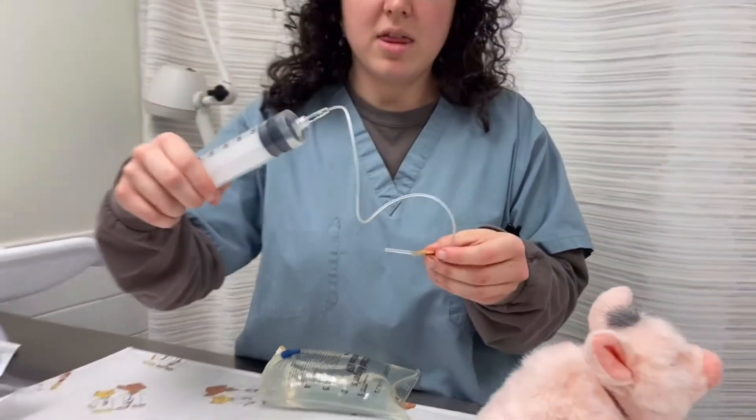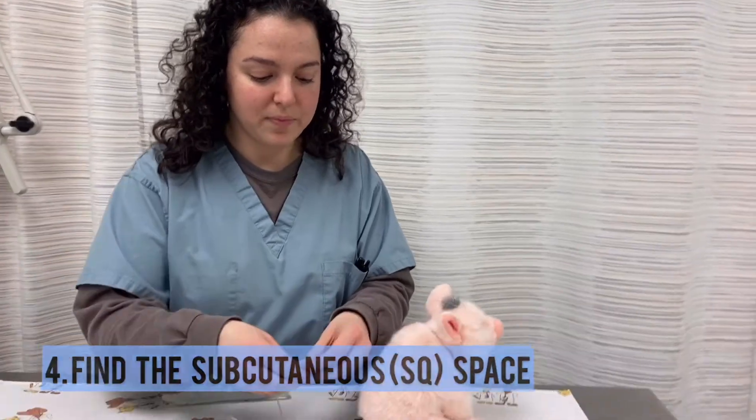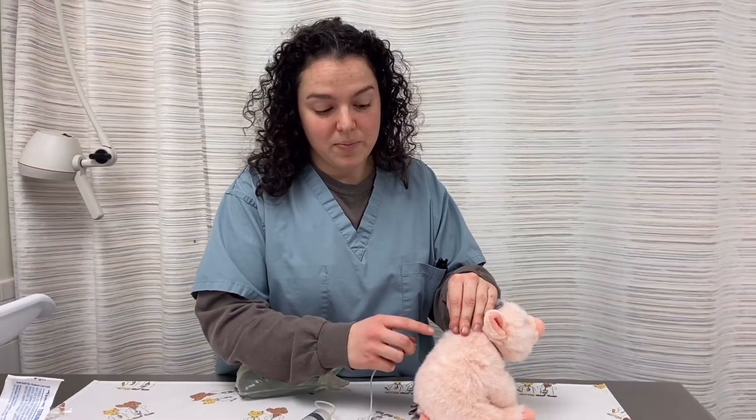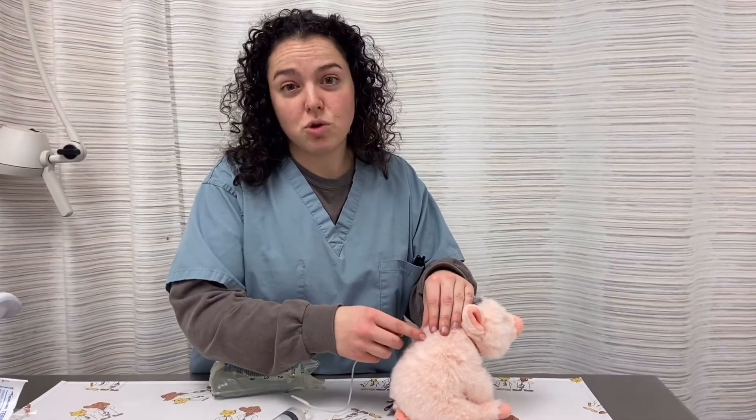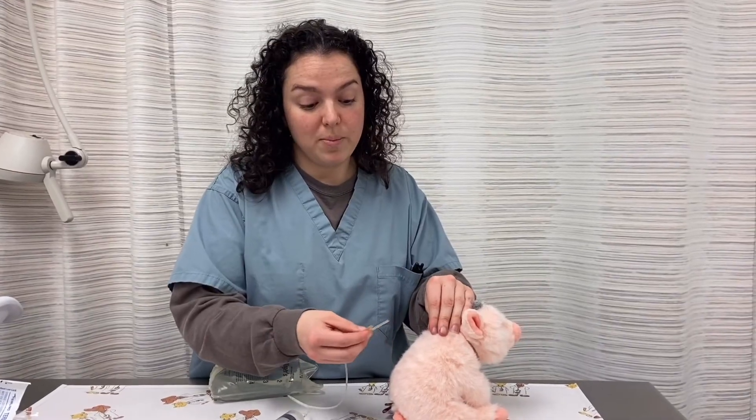When you feel like the line has enough fluid in it, you can find the sub-Q space on your pet. Sub-Q just means all the space that's between the skin and the muscle. We tend to use between the shoulder blades because there's a lot of space there, and it's the least sensitive to placing a needle.